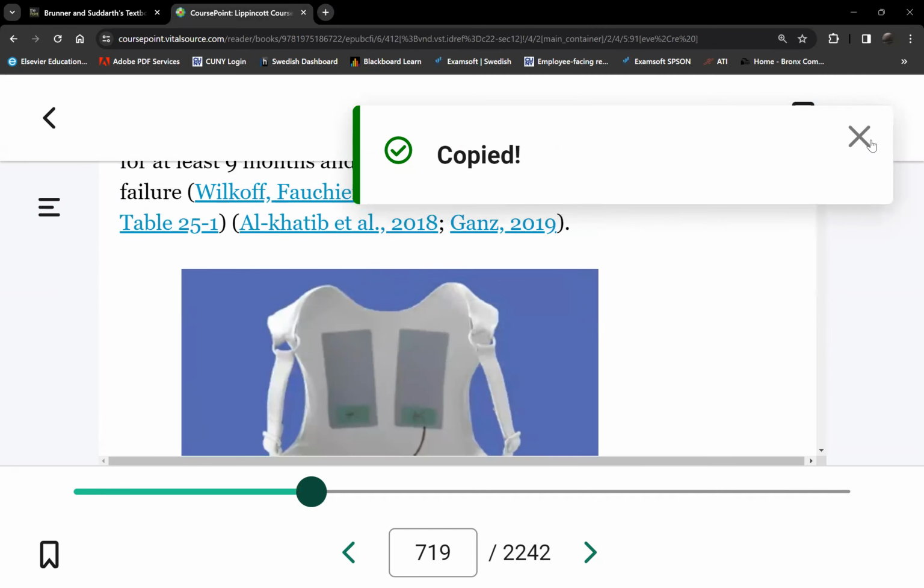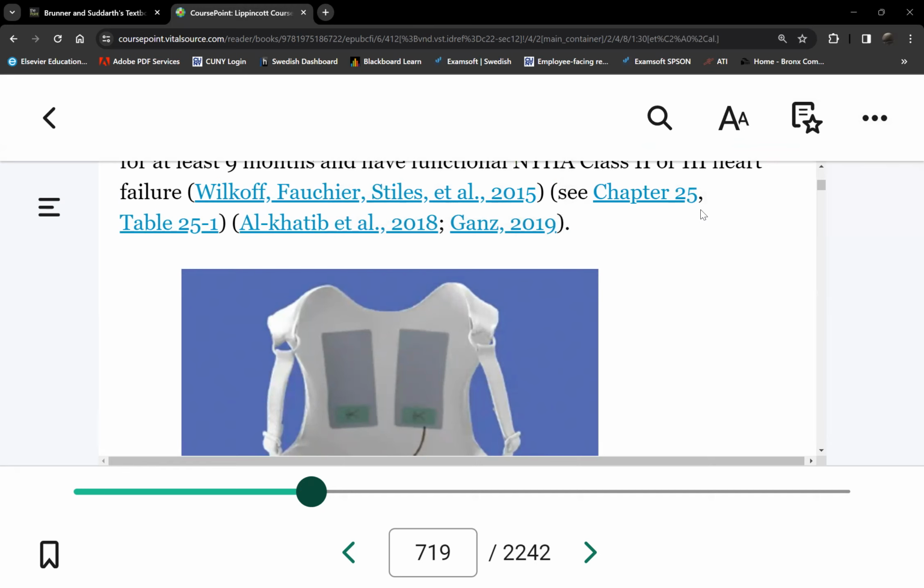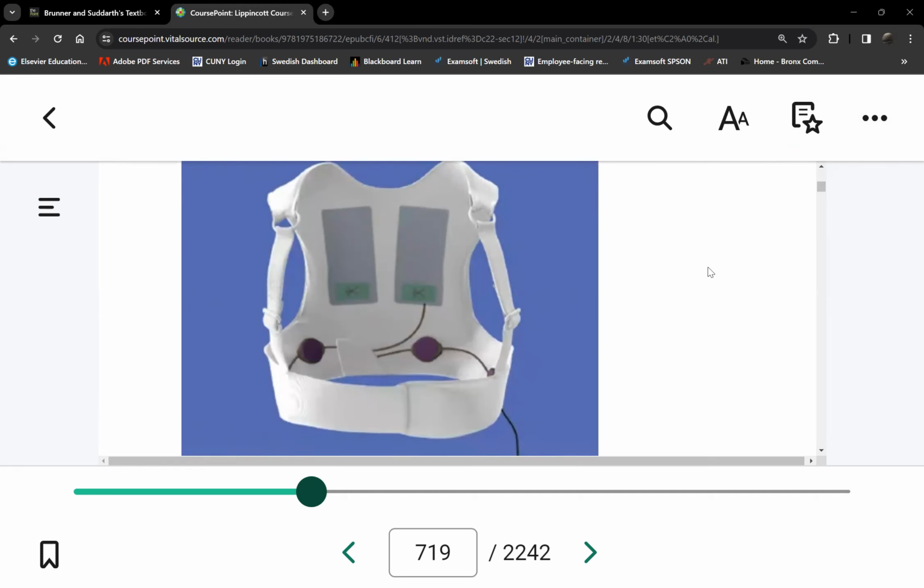Okay, remember the bridge we talked about earlier in transvenous pacemakers? All right. So the same thing happens to patients who require an ICD, but they have an active infection and therefore we can't implant an ICD yet, right? Okay, so we have an external ICD.